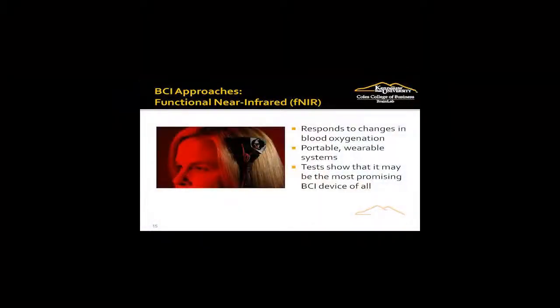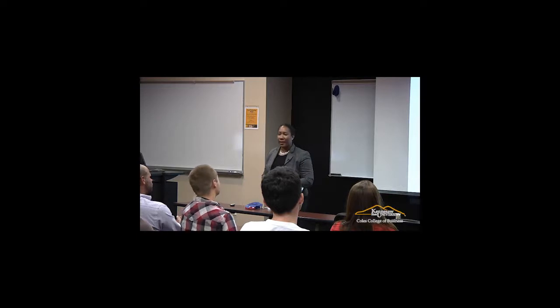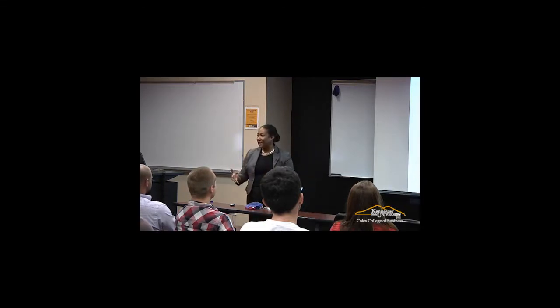So the last one here, looking at blood flow in the brain. Well, we can measure it through infrared, and what you're seeing here is a little puck that kind of gets placed over the language area of your brain. This is probably the easiest area to monitor, where if I have you think about saying some word in your head, even counting, so forming the numbers 1, 2, 3, 4, 5, 6, we're going to have blood flowing to that area of the brain. Now, if I have you just think of something nonsensical, something meditative, la, la, nothing will happen there. It's not a real word that you're forming.